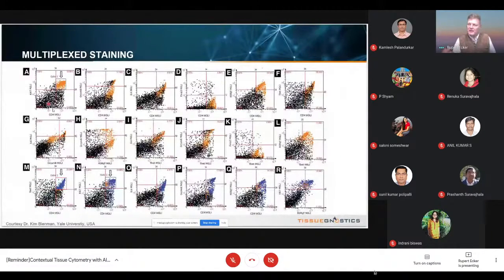We see here that CD4, Ki67, granzyme B, interleukin 6, FOXP3, and other markers have been quantified, but the cells that you see here in all the figures from A to L are always the same cell population on the same tissue section, right? With some 10 markers stained, not simultaneously, but in a cyclic way using this multiplexing approach.